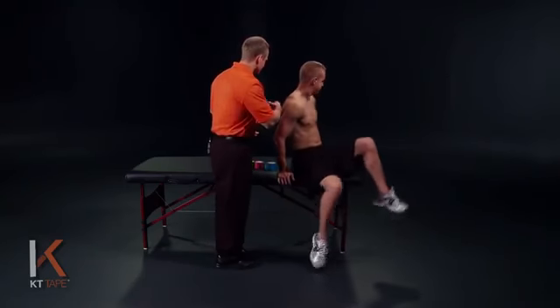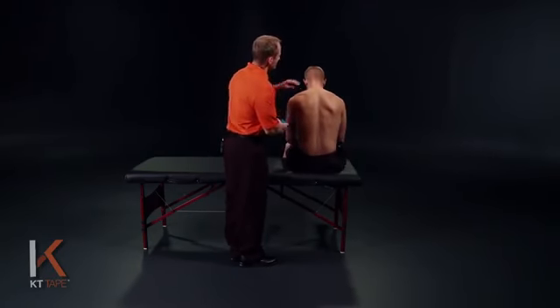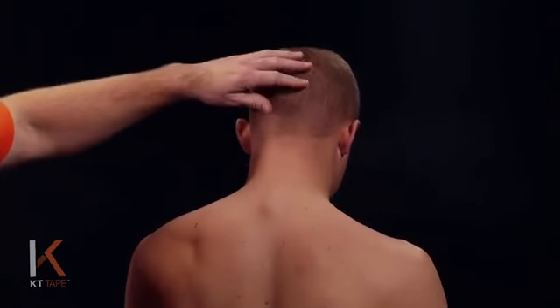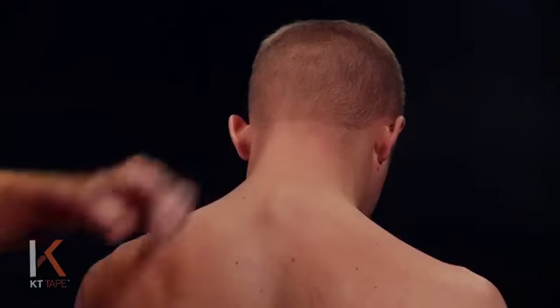KT tape helps treat this condition by assisting in posture, relaxing muscles, relieving pressure to reduce pain, and may increase circulation. So for this application, we're going to have John go ahead and spin around so we can see the back of his neck. And we're going to position him by stretching the skin on the back of the neck. So we're going to bring that chin down towards the sternum or the chest as much as is comfortable.